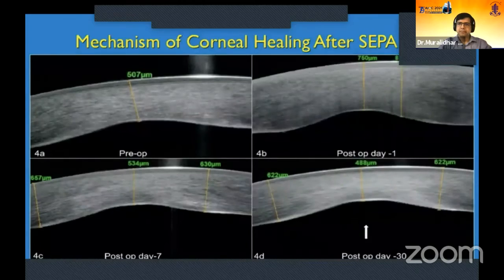We documented the postoperative healing response after SEPA using high-resolution anterior segment OCT. At 1 month postoperative follow-up, the DM is well apposed, and the endothelium was covering the defect, which is sharply demarcated. Clinically, we could also perceive that the stroma is much more compact and transparent postoperatively.